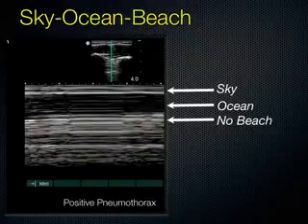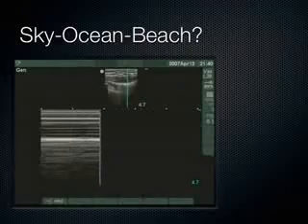Sky, ocean, beach. Nope, pneumothorax. Good job. Okay.